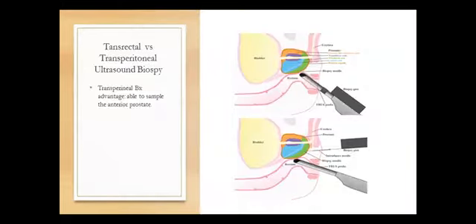So this is a picture of the schematic of the prostatic ultrasound biopsy, transperineal and transrectal. The one at the top is the transrectal ultrasound biopsy.